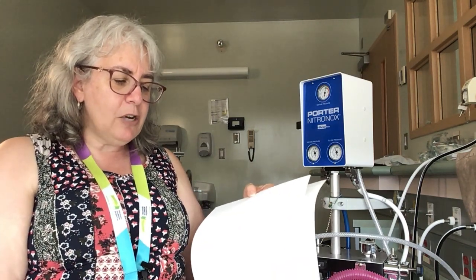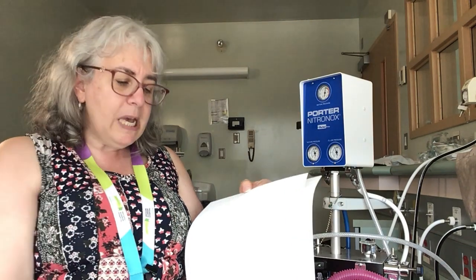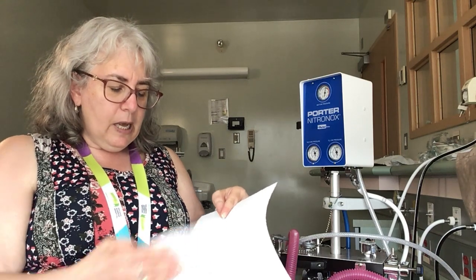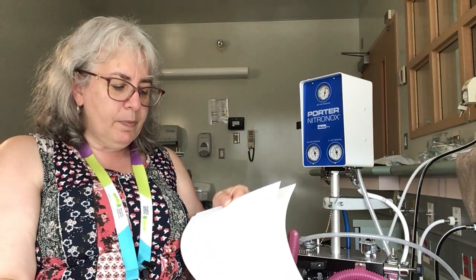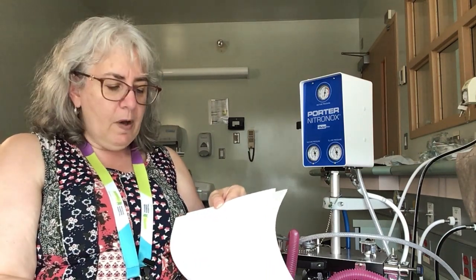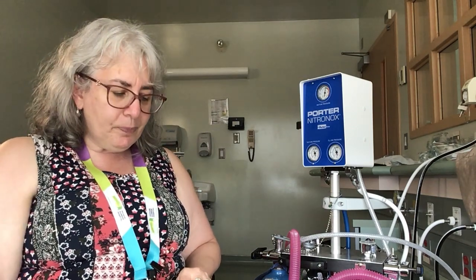Okay. We're going to educate the patient about the need to hold their own mask and about some of the side effects that they may encounter, like dizziness or dry mouth, possible nausea or vomiting. The patient needs to stay in bed the entire time. While they're not using the gas, they may be able to get up to go to the bathroom, and the nurse or the midwife can perform a falls risk assessment and see if that's appropriate, or whether they need to go on a commode chair or they need to go on a bedpan.